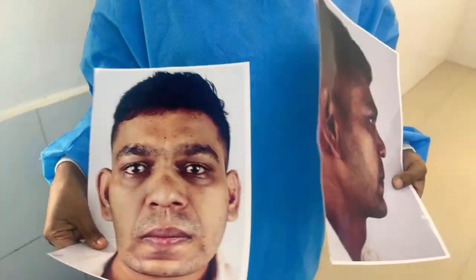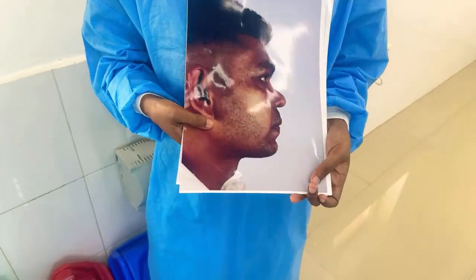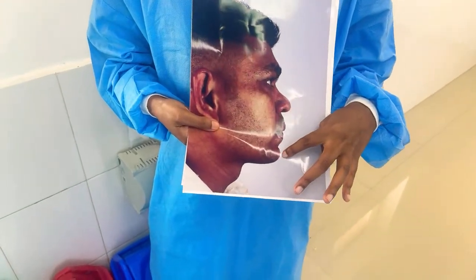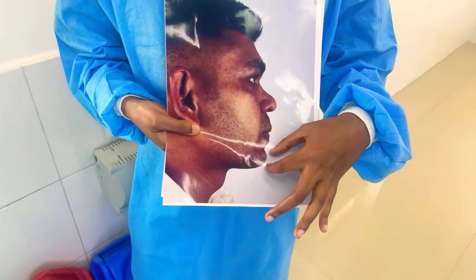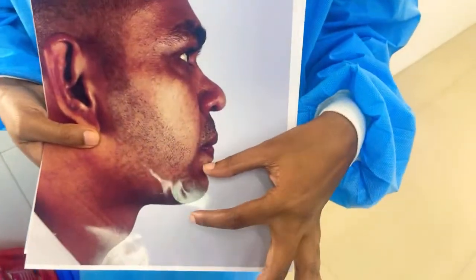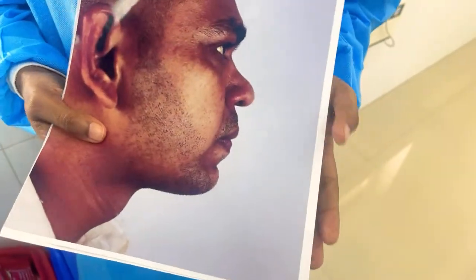Screw fixation is what we just showed you. We want to show you all the frontal and the lateral views. So we are doing augmentation in the horizontal plane. We are bringing the chin forward and downwards and fixing it in a position that will correct the asymmetry as well as give him a much more aesthetic look.